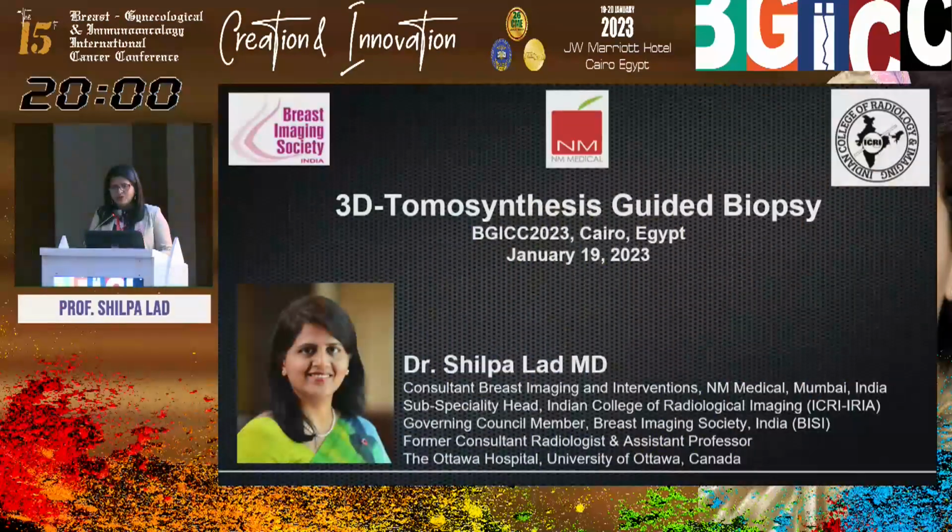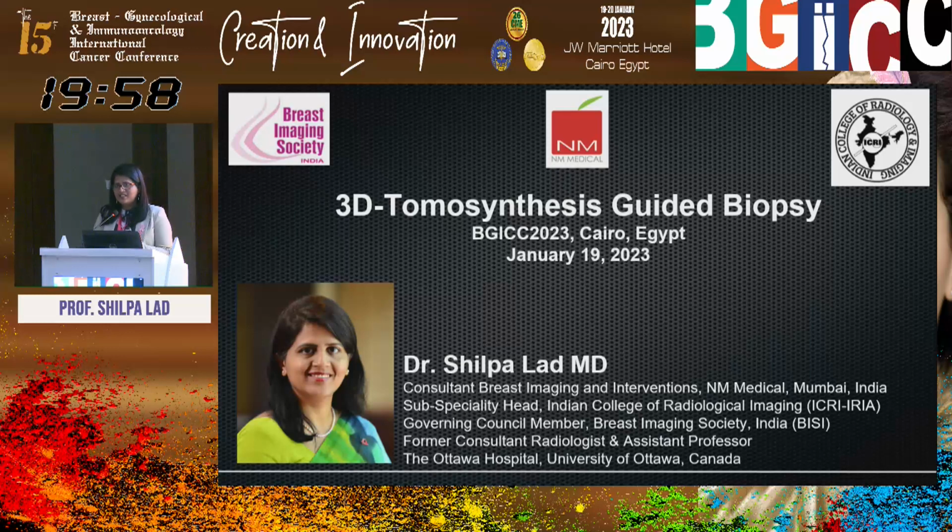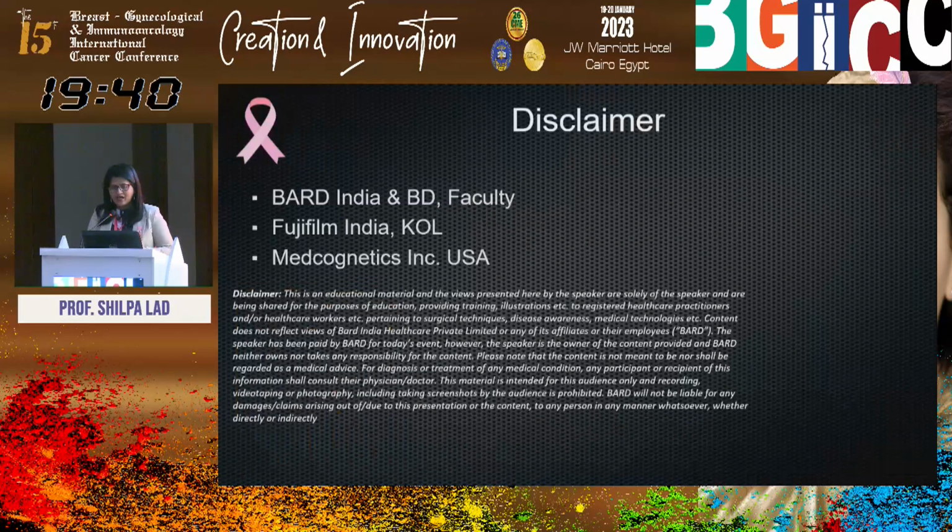Without any further ado, the topic for today is 3D tomosynthesis guided biopsy. We just heard a wonderful talk by Dr. Mike Linver on tomosynthesis detected lesions. These are lesions which are seen only on tomosynthesis. Nonetheless, they are very, very concerning. So how do we deal with them? That's the question at hand.